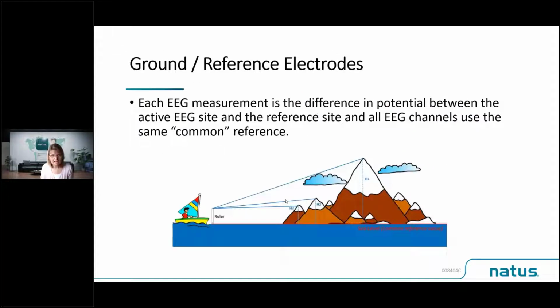So I mentioned ground or reference electrodes, excuse me. And this is important. I get a lot of questions that say, well, do we really need the ground or reference electrode? Do we really need to use it? And the answer is yes. And I'm going to try to explain to you briefly why.